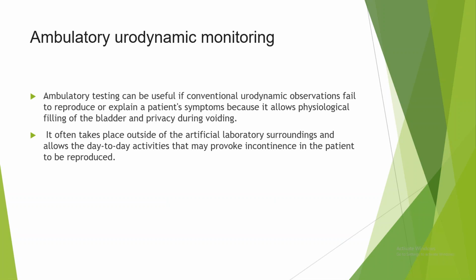Now, what is ambulatory urodynamics? It is usually done outside the clinical setting, not inside the clinic. It allows the patient to record these urodynamic studies while doing her day-to-day activities. Sometimes, when we do it in the laboratory, it may not represent the patient's true symptoms or leakage, because she may not leak every time. She may leak sometimes and sometimes not. So, to confirm the diagnosis, ambulatory urodynamics while doing day-to-day activities may be helpful.